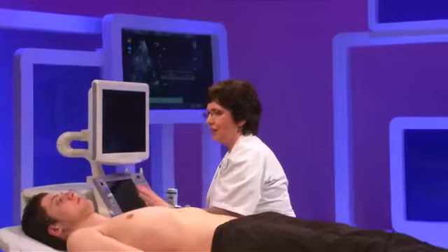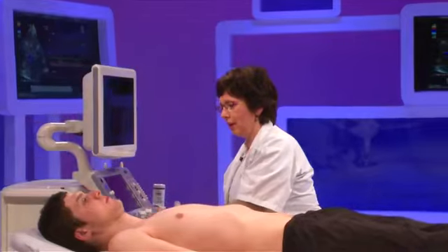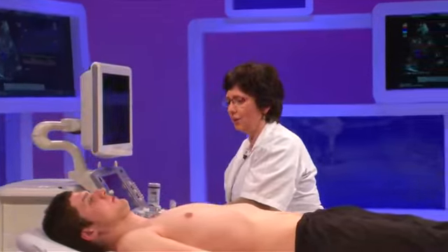So I just want to emphasize that for carotid examination, you must be very strict, and before concluding there's severe stenosis, you must check direct and indirect signs, and you won't make a diagnosis with one argument only. Key points of this examination are that we have to provide a systematic approach, to have a good alignment with the flow, and also not to rely on one single parameter to assess carotid stenosis. And finally, to look at direct signs, but also at indirect signs at the level of the other arteries.